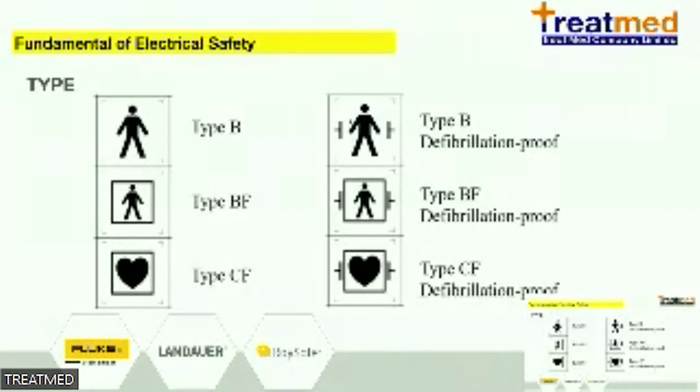The device can be damaged if it is not defibrillation proof. If it is, they can be used together.